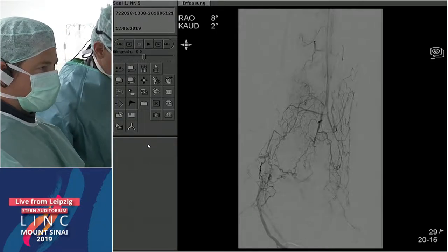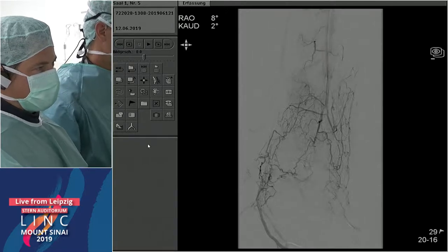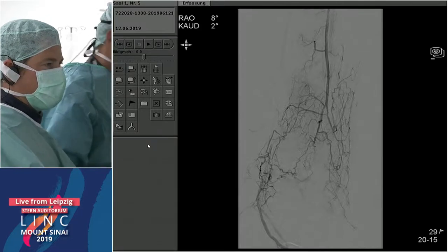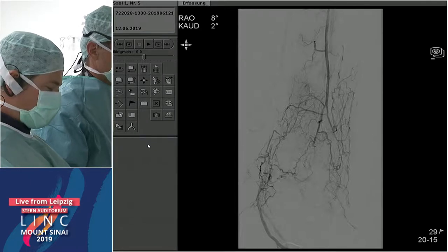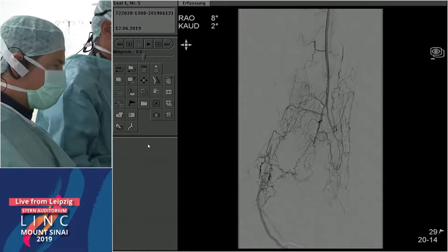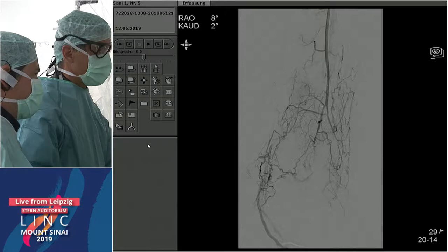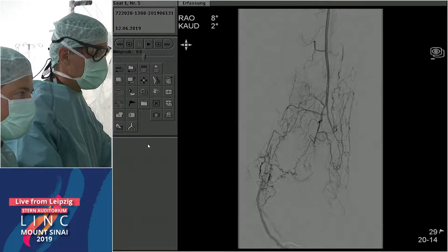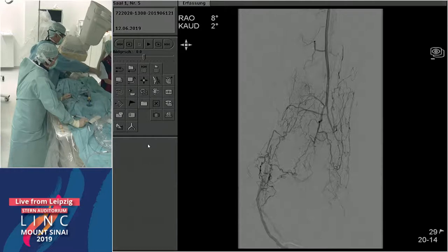This shows us the foot perfusion. The peroneal is not feeding the collaterals to the anterior tibial or dorsalis pedis, and also not very well to the posterior tibial. We decided now to go for a retrograde puncture in the arch of the posterior tibial artery. Andre is performing that now. Maybe we have the duplex connected so we can show it on screen.